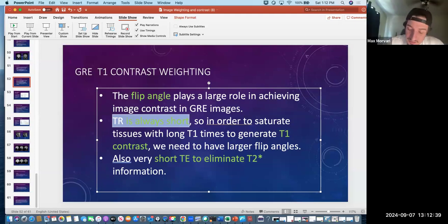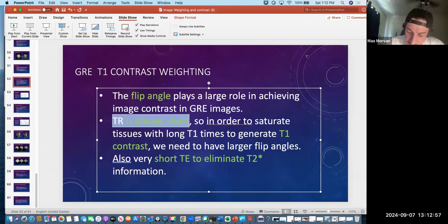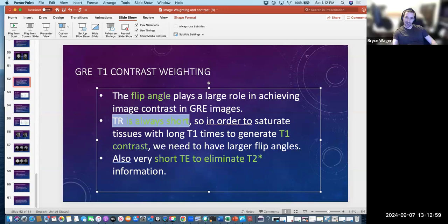You decrease it to 15 milliseconds. Well, you want it small, smaller than 15. And then how do you minimize T1? You bring down the TR. No, forget TR, remember? What was your original question? Ask that again.